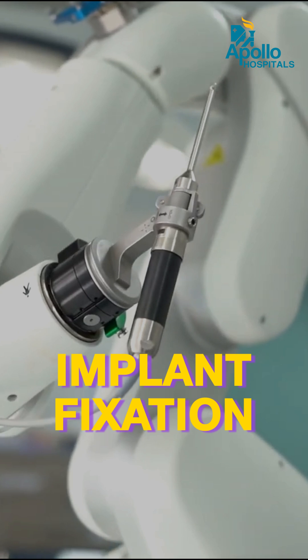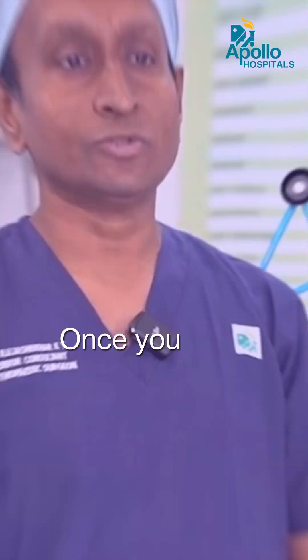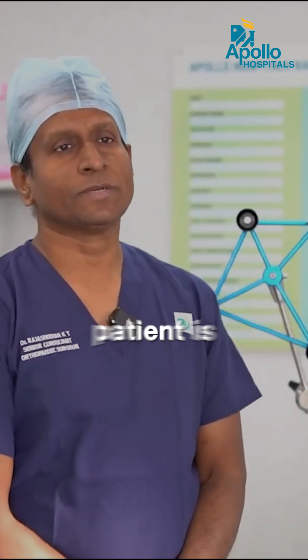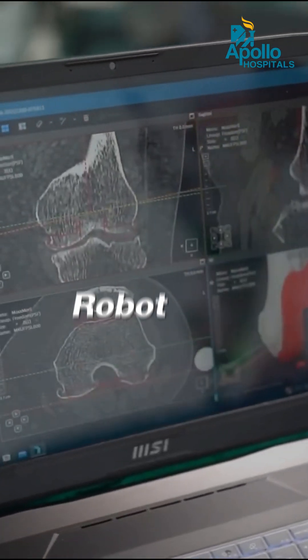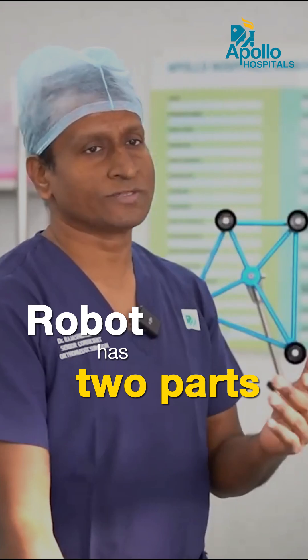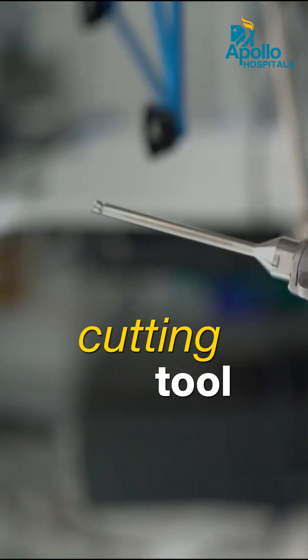Once the cut is so perfect, the implant fixation will be far superior compared to handheld machines. When you go to the operation theater where the patient is shifted and anesthetized, the CT information is loaded onto the robot computer. The robot has two parts: the robot arm and the burr, which is the cutting tool.